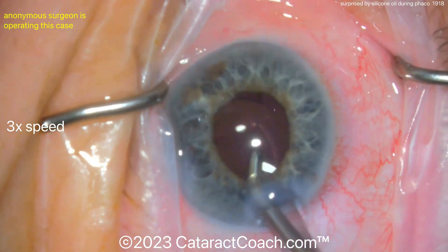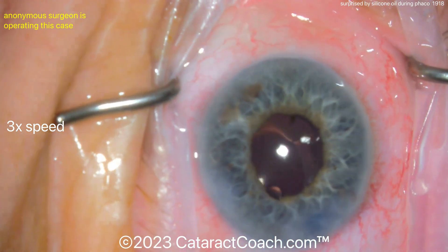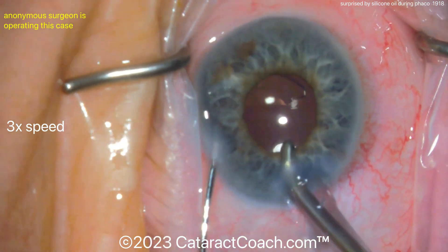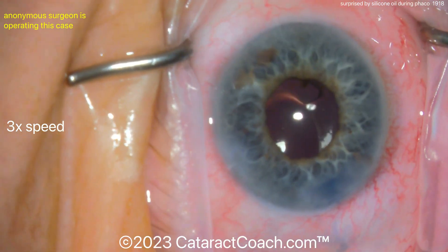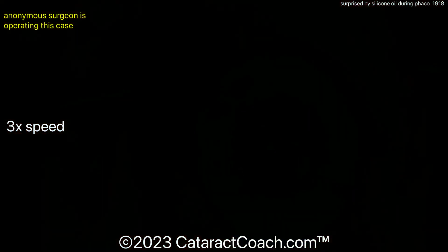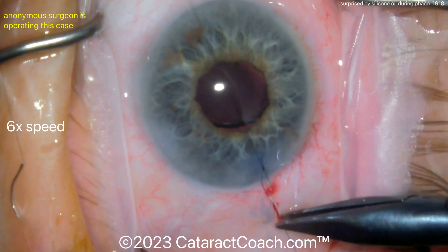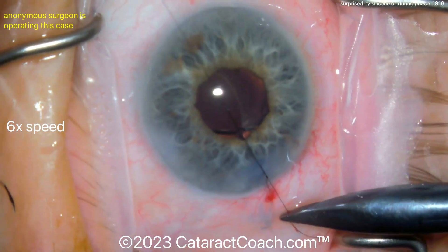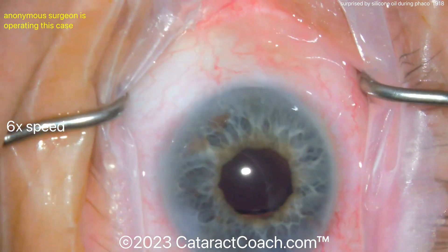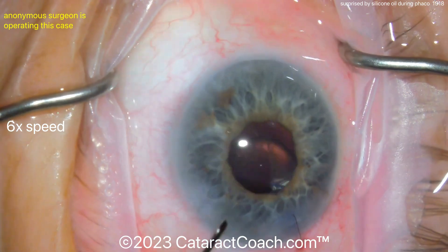Important clues — you should notice this ahead of time. Always ask yourself: why did the patient suddenly get a white cataract just a few weeks or a month after vitrectomy? Think about it. Here's the end of the case — just suturing it up. Place a suture here because you know the patient's going to have a vitrectomy relatively soon and you don't want that main incision to open up.